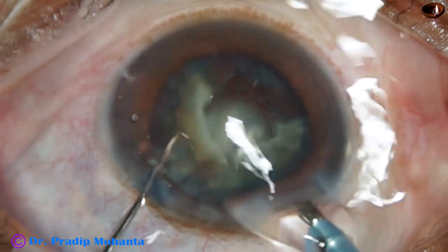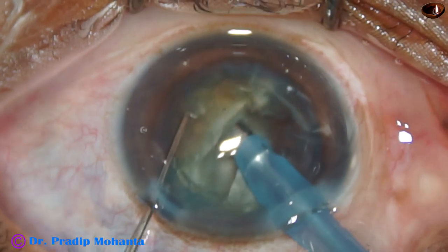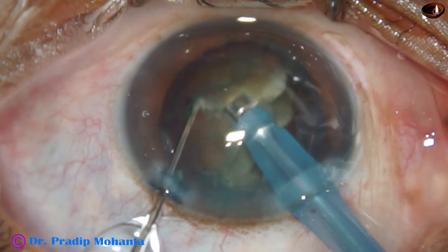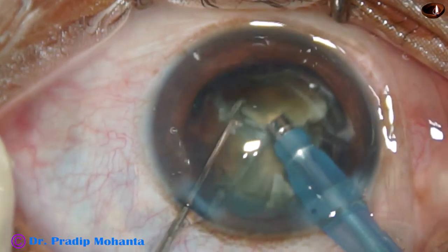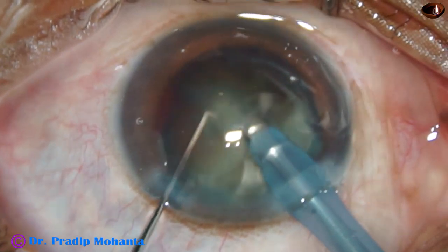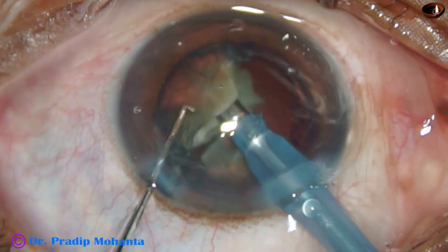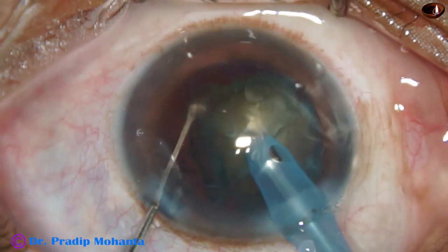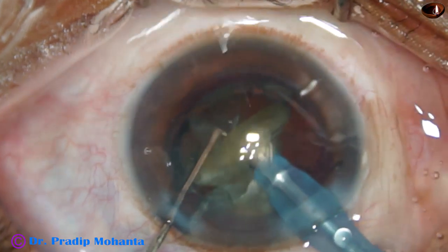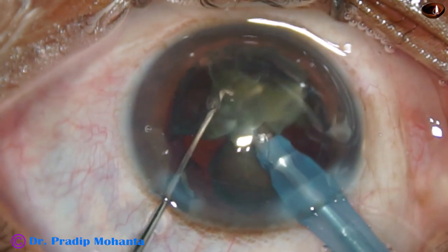Watch what I have done — I came out and without injecting viscoelastic I am going in again. Beginners should not do this. You may touch the corneal endothelium. The precaution I took was to form the anterior chamber right after entering and then advance forward. But please form the anterior chamber nicely before you introduce the phaco needle again.